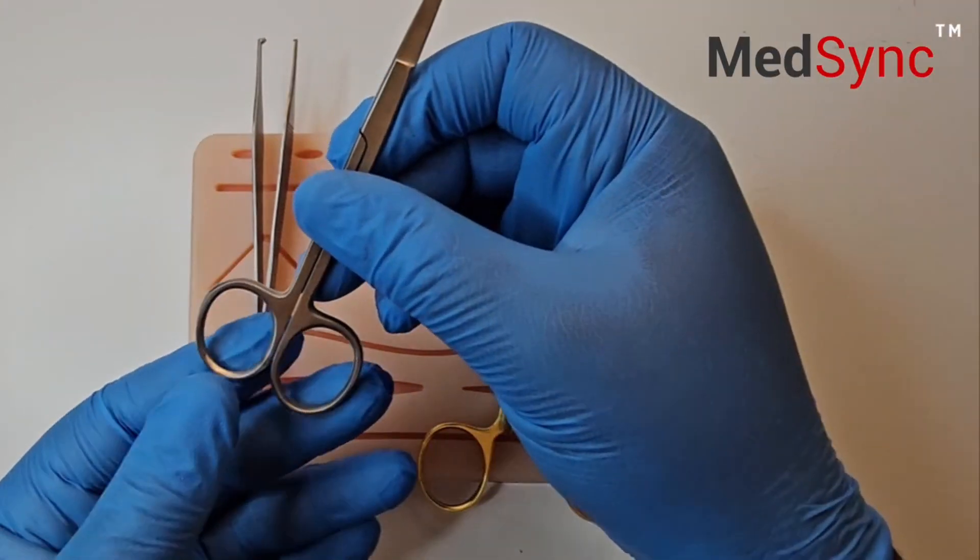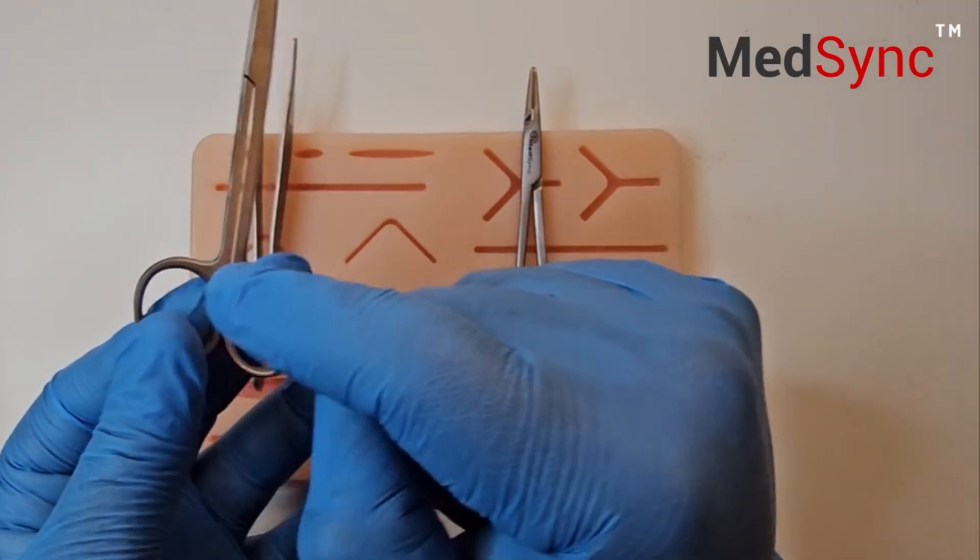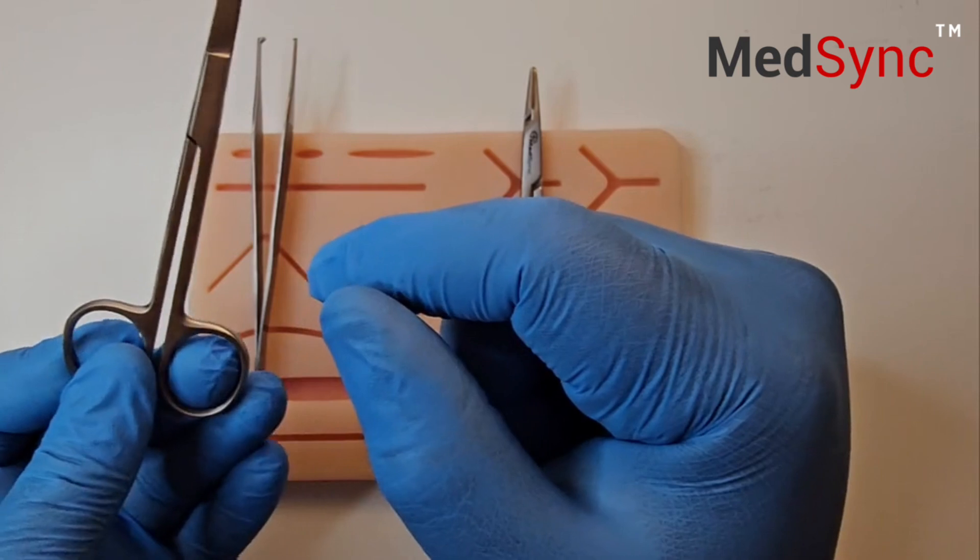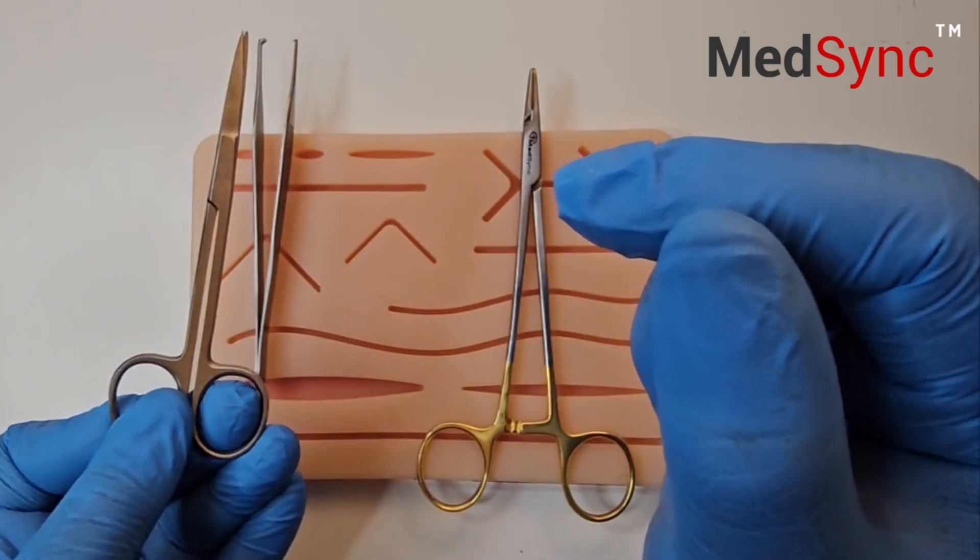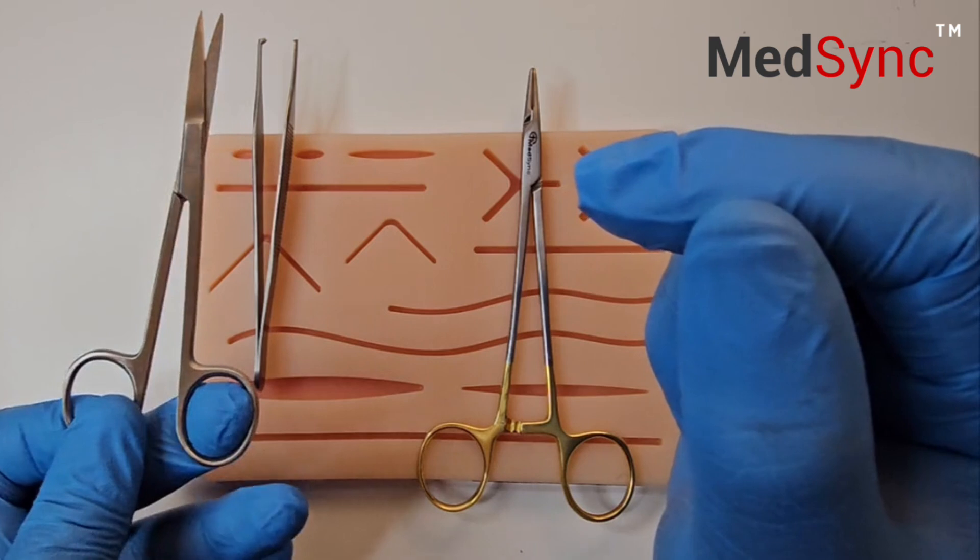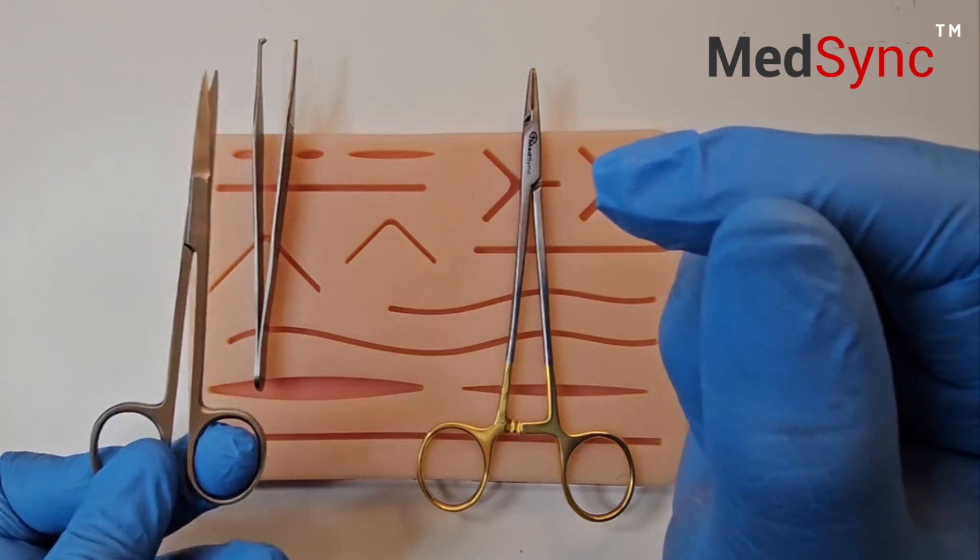If you're cutting with your left hand, one ring is between your thumb and index. The middle finger is on the other ring. You simply apply opposing force and open and close the scissor.